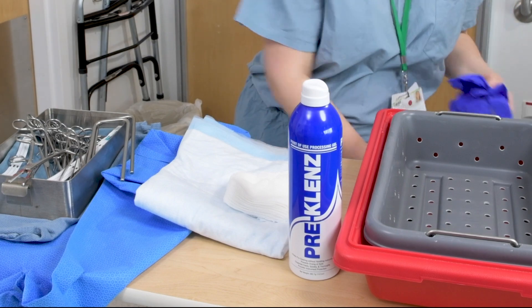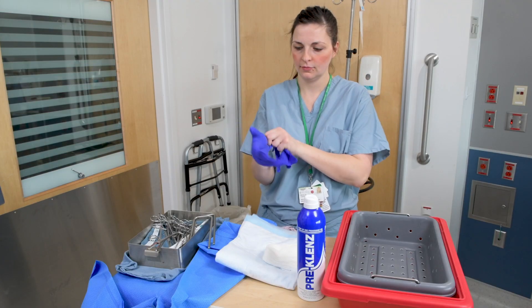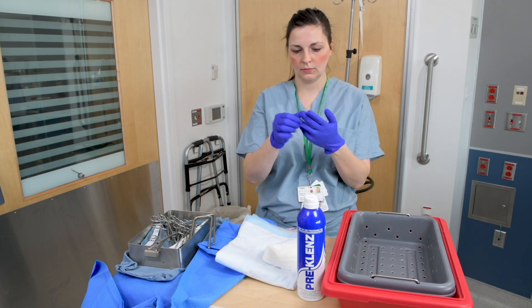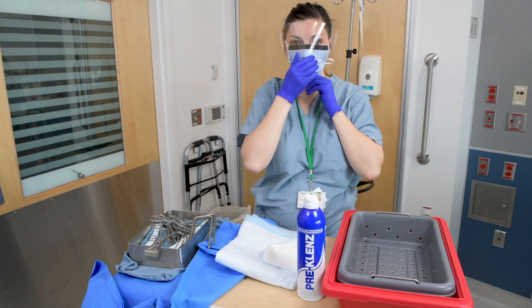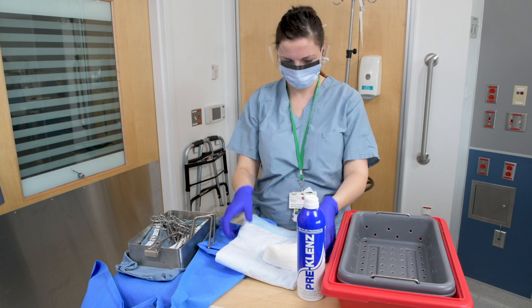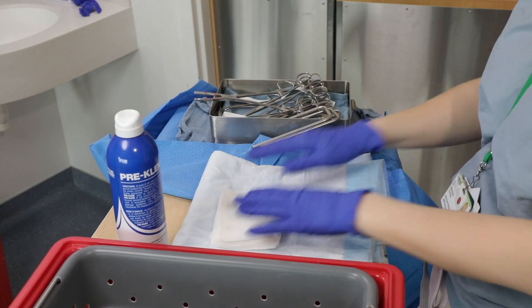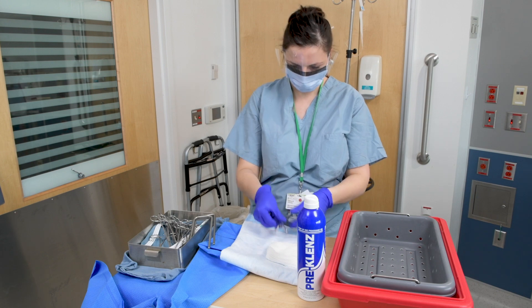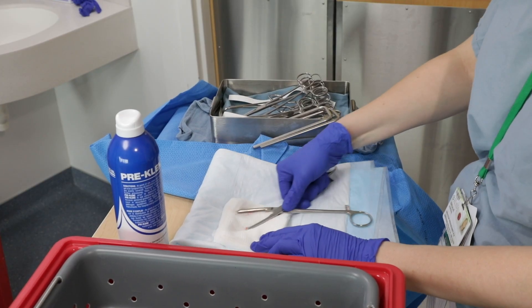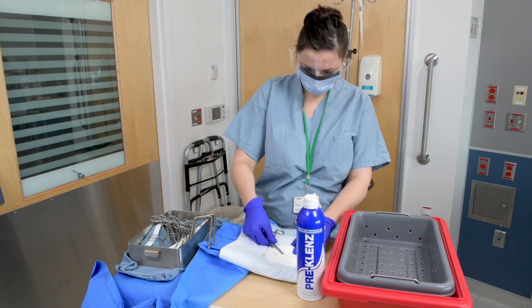For appropriate steps for pre-cleaning with a spray, immediately after the procedure, don gloves and eye and face protection. You can use a mask with a face shield or mask with goggles. Begin by placing a chucks pad or gauze onto a solid surface. With the sharp end pointed away from you, utilize the bread and butter method to remove gross soil from the solid instrumentation.